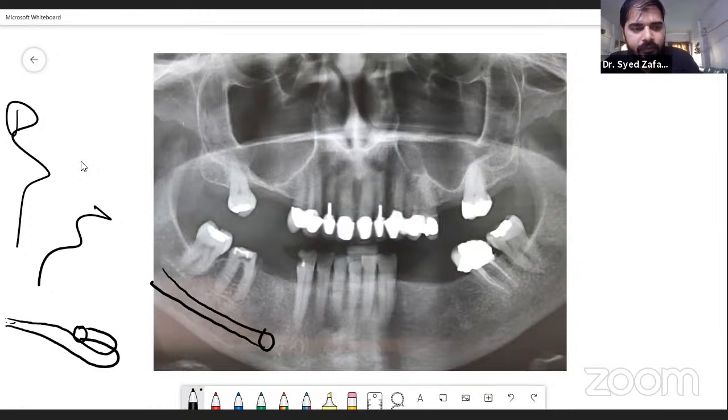So guidelines say when you see the foramen, you have to give a 5 mm safe margin anterior to it. This means if there is a foramen, the nerve will be running 5 mm anterior, so you will also give 5 mm safe margin from it. We already know from the canal we have to give how much?